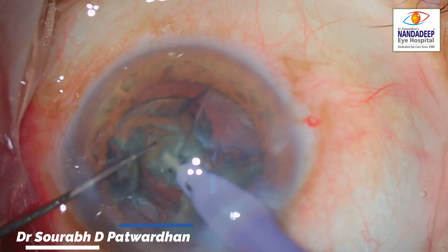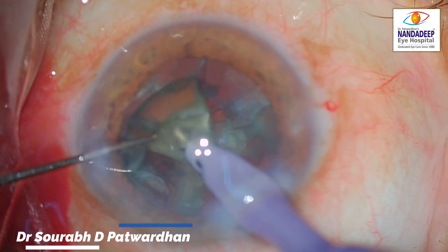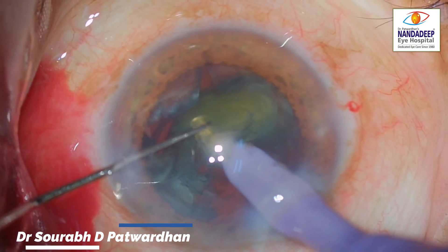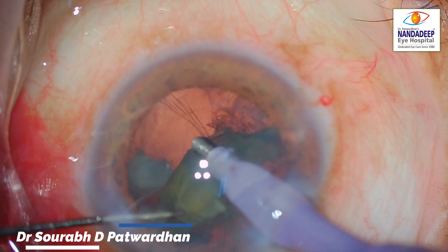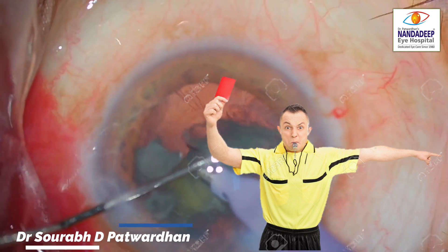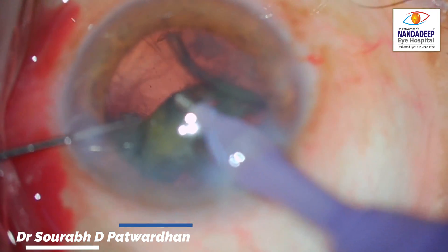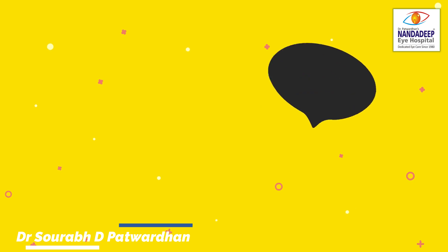You are seeing fluctuations in the anterior chamber as he emulsifies the piece that was guarding the other piece. Again, look at the feco tip — it is still going into the unsafe zone. Now it is very clear that the posterior capsule is wide open. You can see the wrinkles at the edge of the tear. Now the trainee realizes that something is not going right and withdraws the probe.